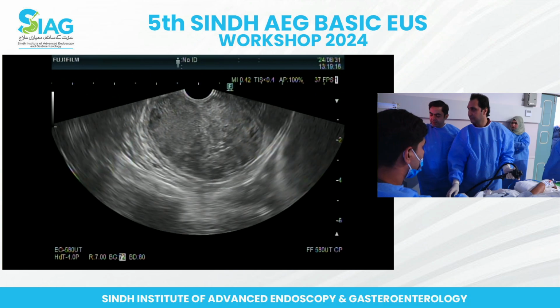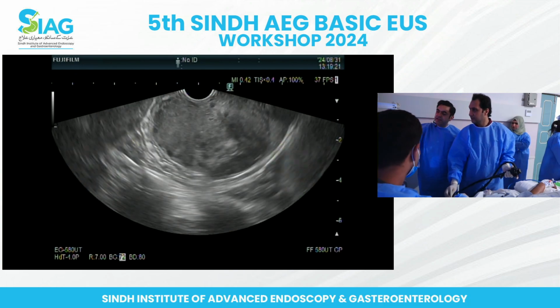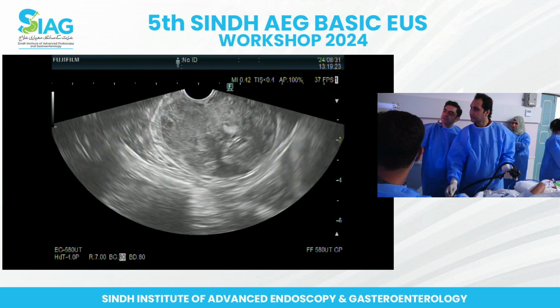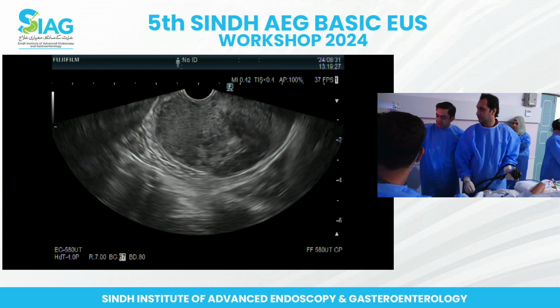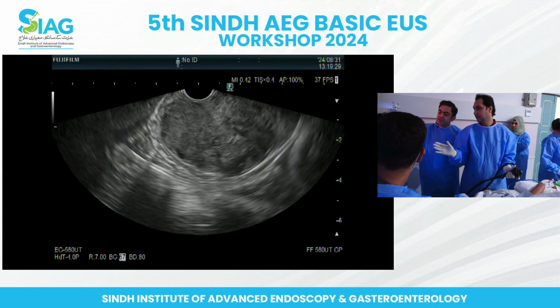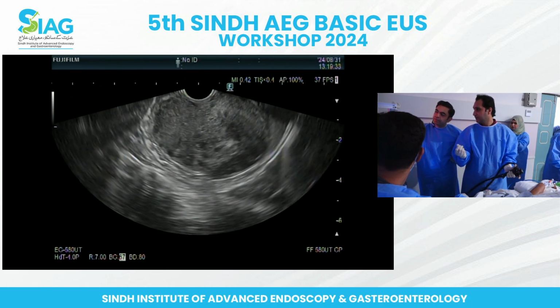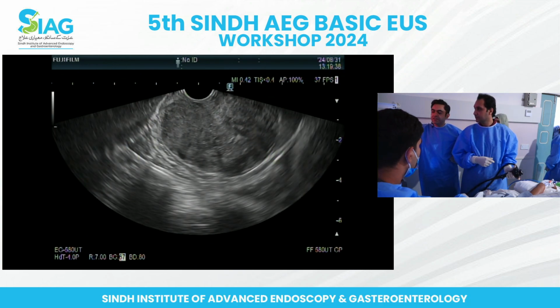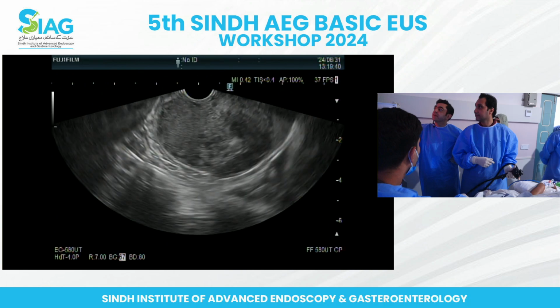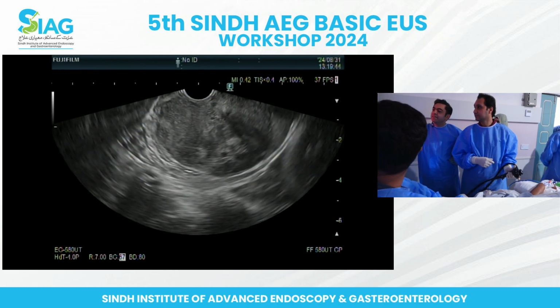selecting that. वे तो पॉज करना आना चाहिए आपको, प्ले करना आना चाहिए. अच्छा, this is the gain, देखें ब्राइटनेस. ठीक है ना, उसके इर्द गिर्द आप इसको कम ज़्यादा करके you can adjust it. और obviously this was what we were discussing, आपने किस लेवल पे करना है. Describe it like a non-homogeneous solid mixed architecture. So heterogeneous, mixed architecture. Shahzad, we can see this is the same one, right? Yes. There cannot be two just same size.